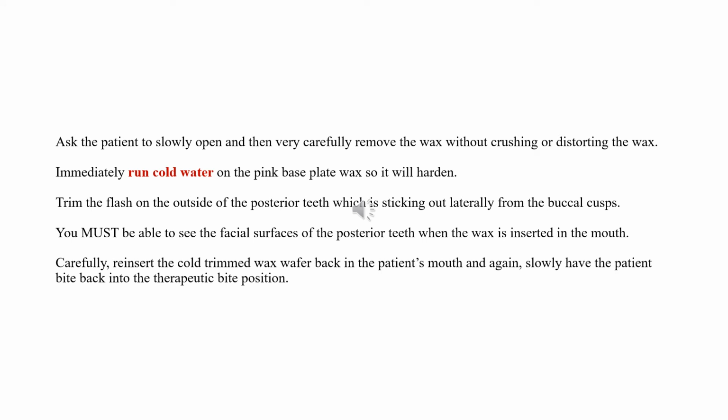So the patient's in the therapeutic bite, you push the wax in, you're waiting a moment or two because it's cooling, and then ask the patient to slowly open vertically, and then very carefully remove the wax without pushing on it or crushing it or distorting it. Remember now, it has to fit the teeth, and if you push it, you'll distort it, it won't fit again. So ask the patient to slowly open and then very carefully remove the wax without crushing or distorting the wax.